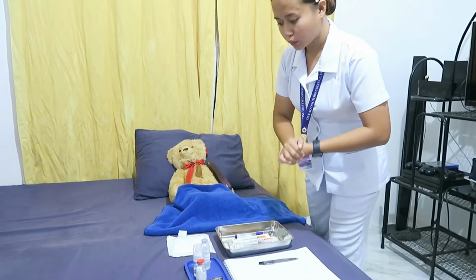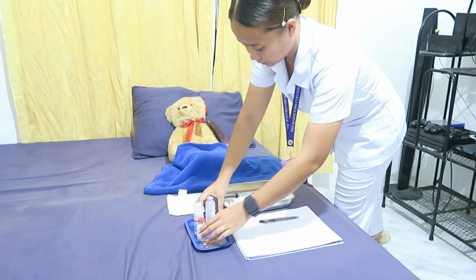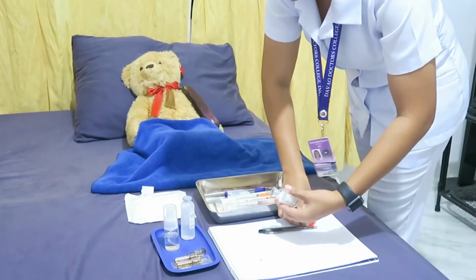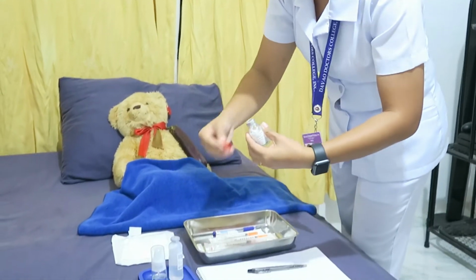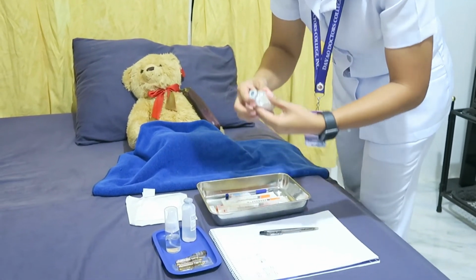So, I'm going to remove the cap. Then mix the solution, not by shaking, just rotating between the palms of the hands.